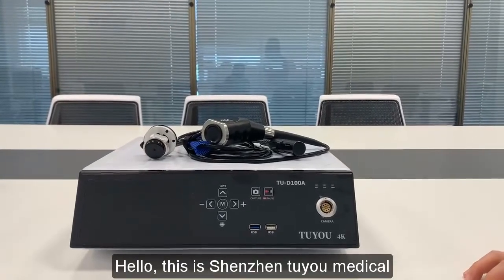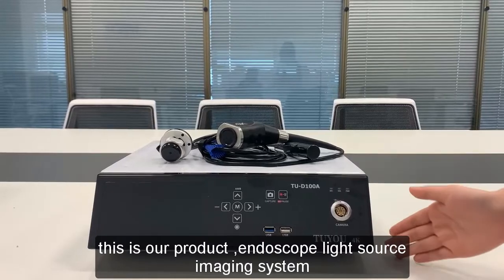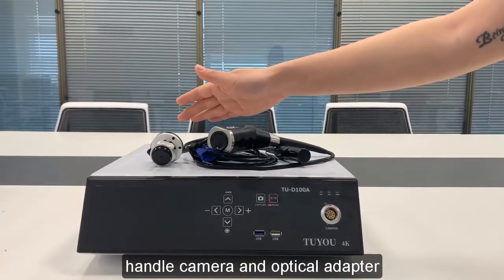Hello, this is Shenzhen Tuyou Medical. This is our product, the Endoscope Light Source Imaging System. It consists of a camera control system, handle camera, and optical adapter.